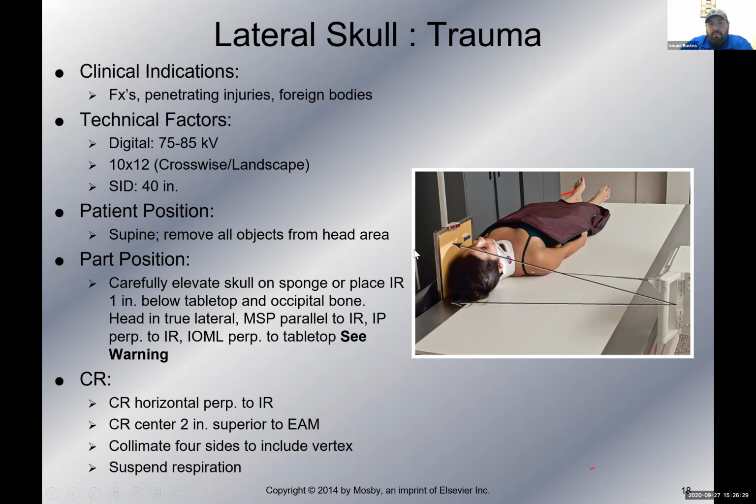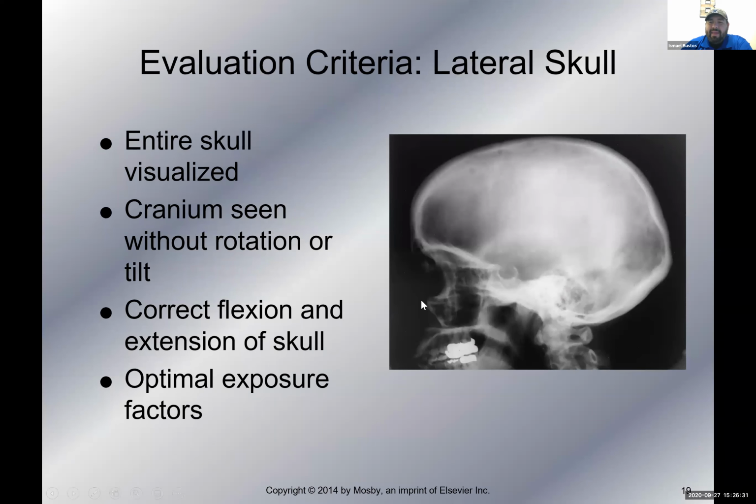All right. Here's what it looks like. Again, the entire skull visualized. Make sure you get the vertex and everything. We want to make sure that we don't see any rotation or tilt, right? Those are the biggest things we look for, rotation and tilt.